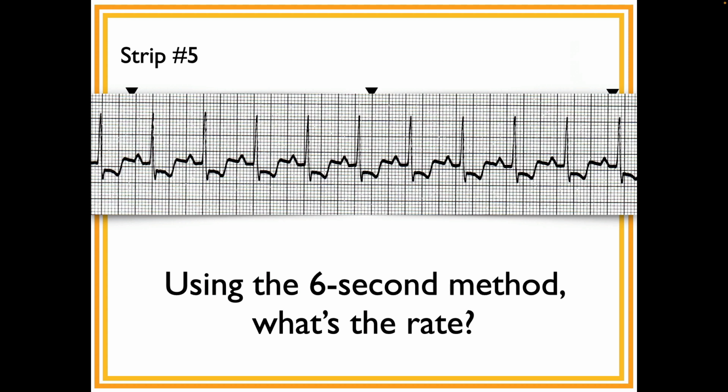Why is it called six-second strip work? That's 6 seconds. Multiply whatever count you get.